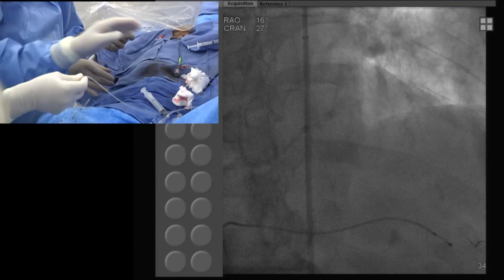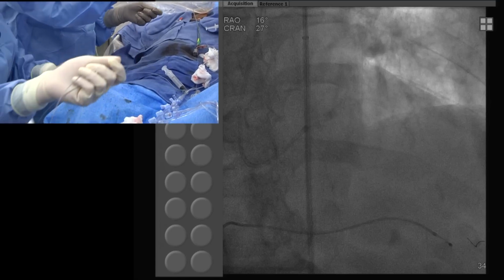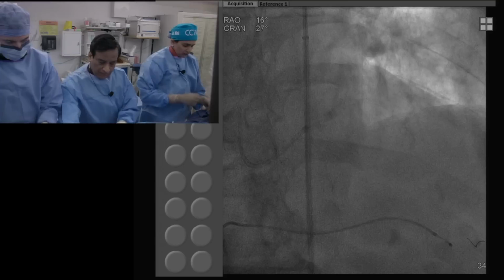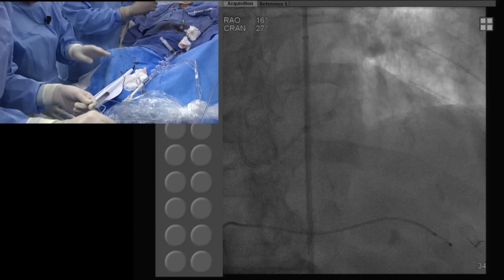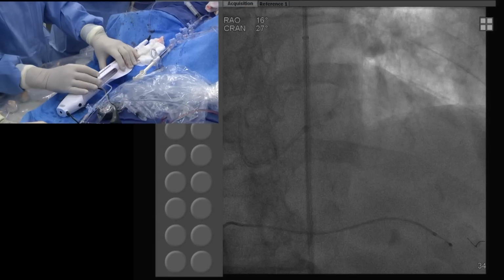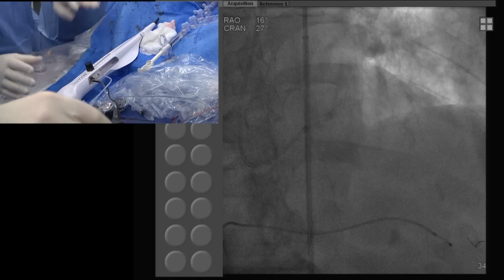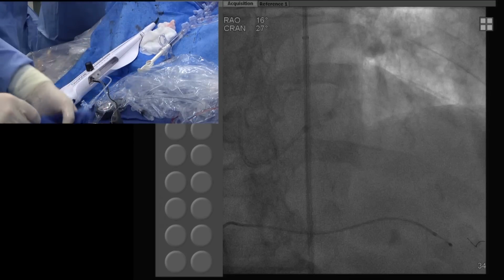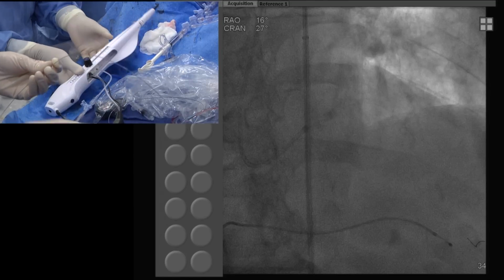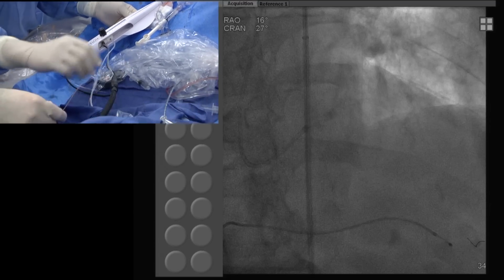So now you see that setup of the Rota Pro. Clearly it has a lot of plus and some minus, and I'll tell you the minus. The plus is everything is on the table, on the Rota console, your advancer knob. So no worry about the tachometer, your pedal, everything is there. The speed is usually fixed. The little disadvantage, which they are changing, is the cable. The cable comes with a curve.